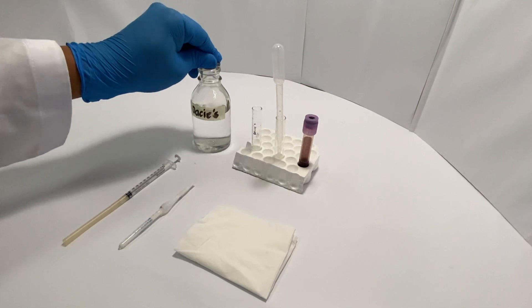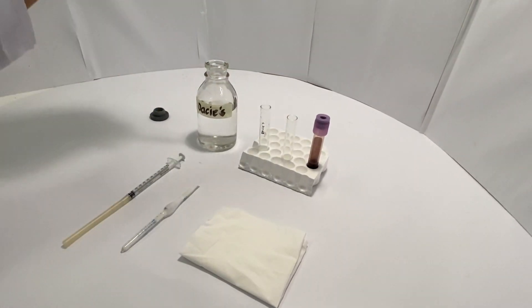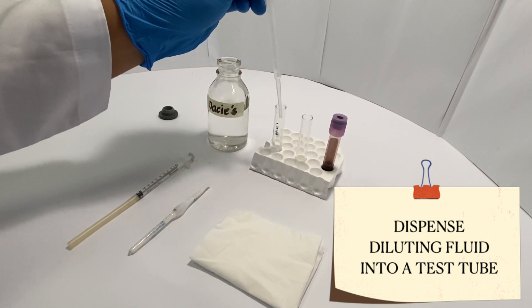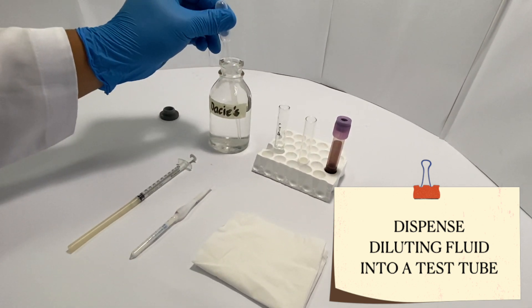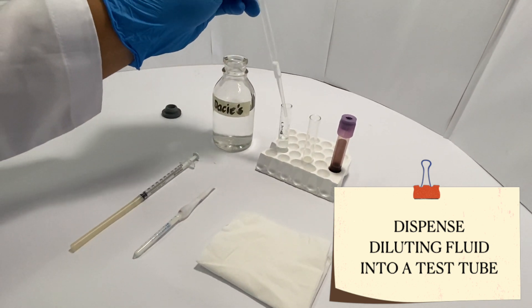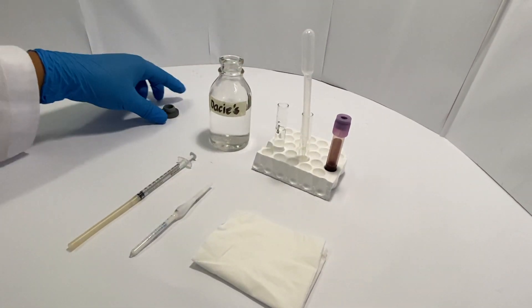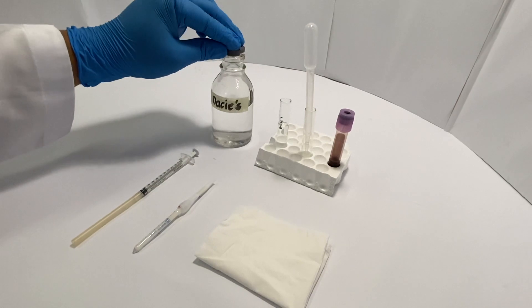For the procedure, first dispense an aliquot of your dilution fluid into a test tube. Make sure to fill the test tube at least three-fourths of the way to make it easier for you in the next steps. After, always cap your reagent bottle to avoid contamination.